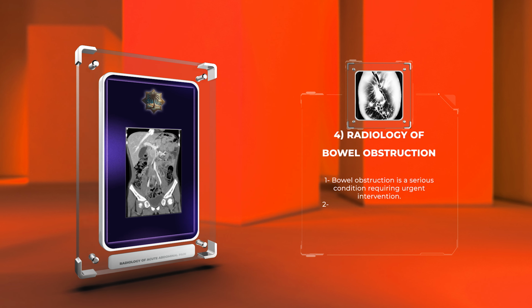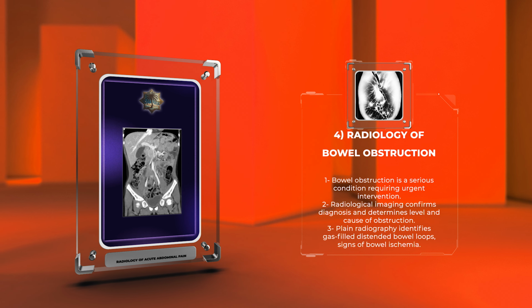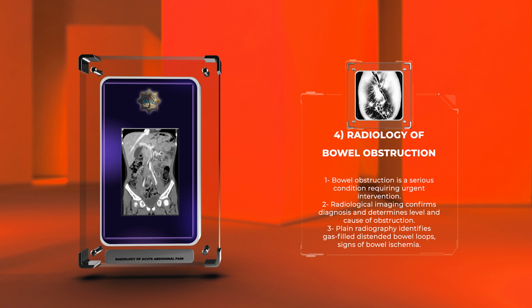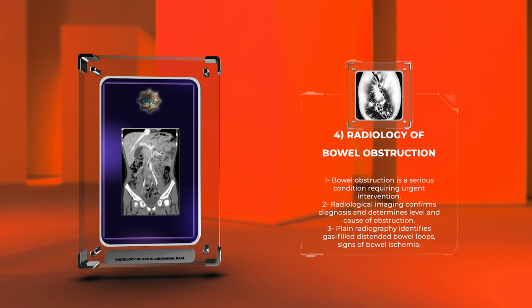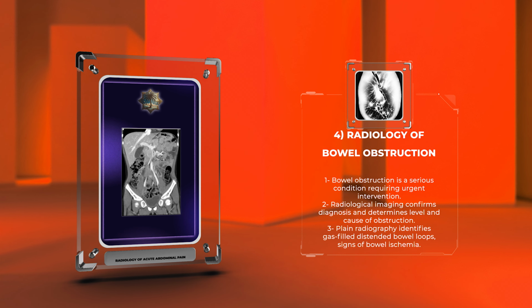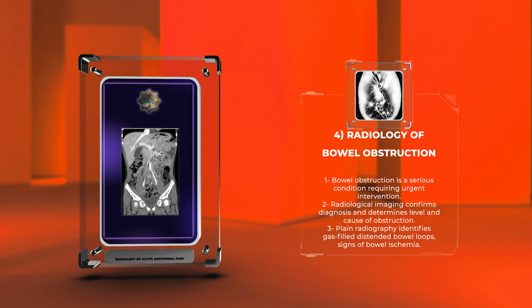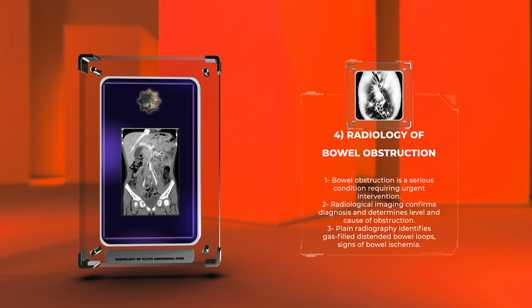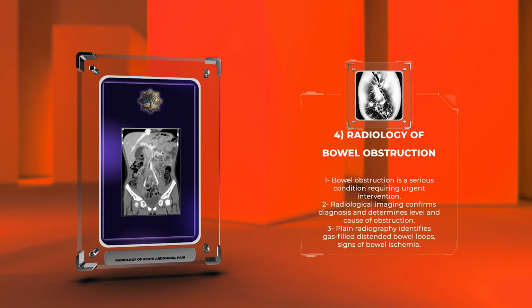Bowel obstruction is a potentially serious condition that requires urgent intervention. Radiological imaging plays a crucial role in confirming the diagnosis, determining the level and cause of obstruction, assessing complications, and guiding treatment decisions. The imaging approach for bowel obstruction typically starts with plain radiography. This initial assessment helps in identifying the presence of gas-filled distended bowel loops, air fluid levels, and signs of bowel ischemia. However, other modalities like CT scan or fluoroscopy may be required to further characterize the obstruction and guide management.